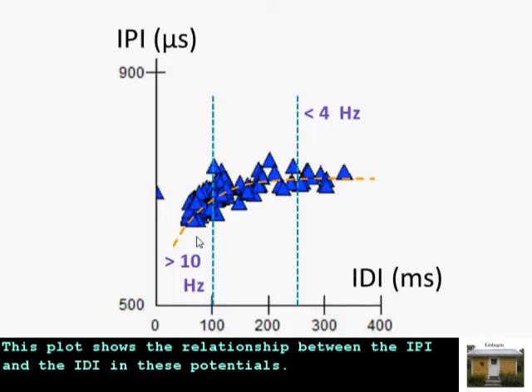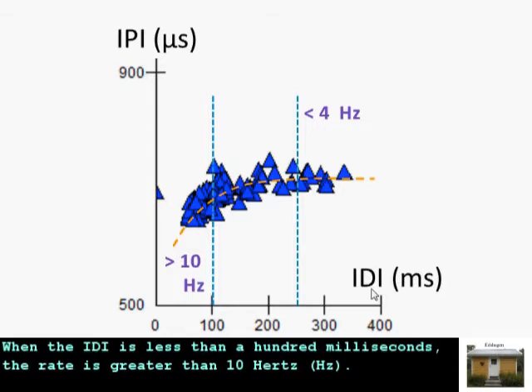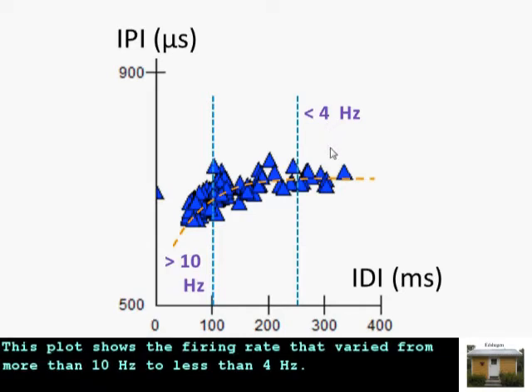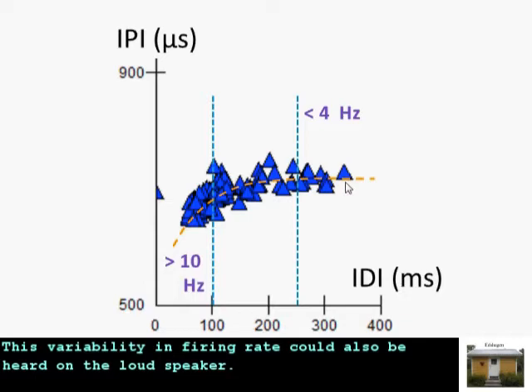This plot shows the relationship between the IPI and the IDI in these potentials. When the IDI is less than 100 milliseconds, the rate is greater than 10 Hertz. And when it's greater than 250 milliseconds, the instantaneous rate is less than 4 Hertz. This plot shows a firing rate that varied from more than 10 Hertz to less than 4 Hertz. This variability in firing rate could also be heard on the loudspeaker.